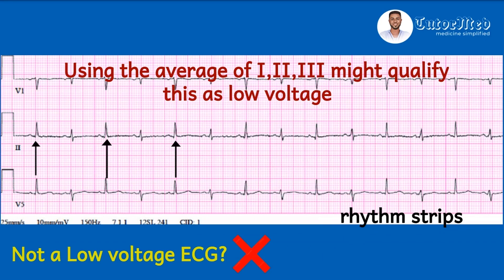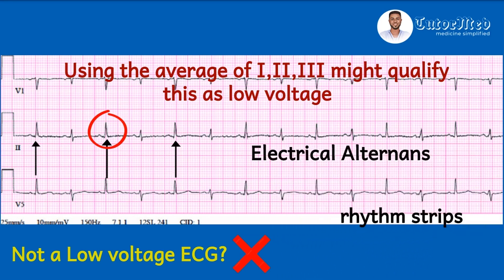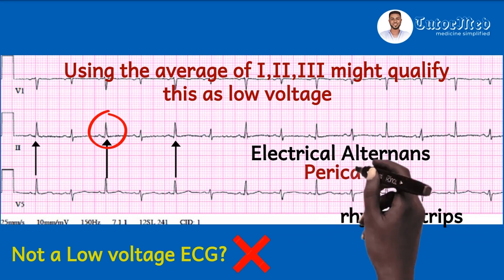For the demonstration of significant pericardial effusion, look at the QRS complexes in lead II. A relatively tall QRS complex alternates with a relatively short one — the first is tall, the second short, the third tall, the fourth short, and so on. This alternating amplitude of the QRS complex is known as electrical alternans, and it is very characteristic of massive or significant pericardial effusion.